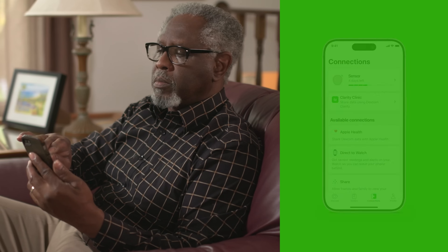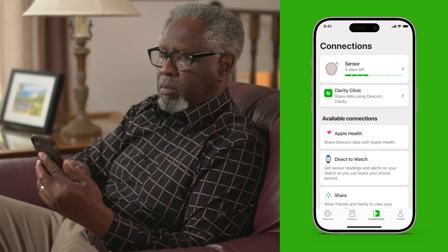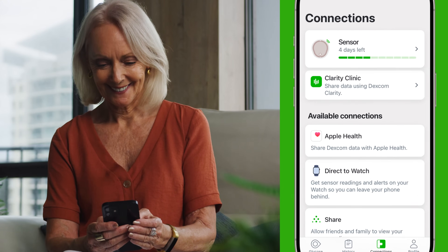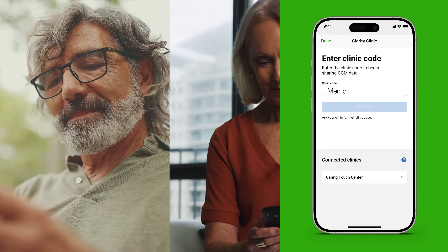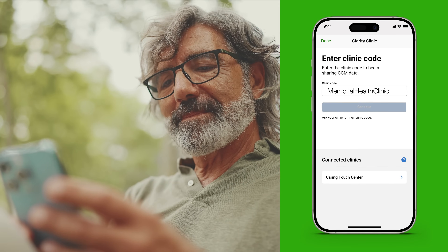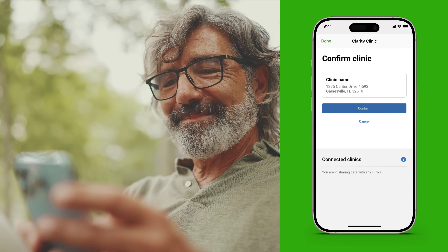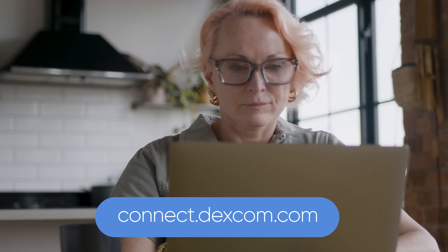Patients on Dexcom apps can set up data sharing right within the app by going to the connections tab, selecting Clarity Clinic, and entering your clinic code. Patients can also set up and edit data sharing by visiting connect.dexcom.